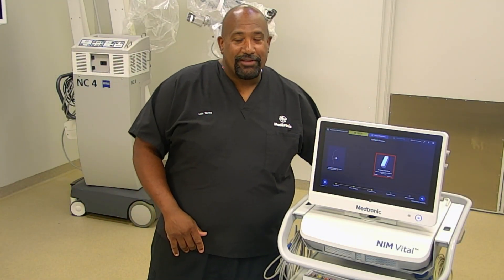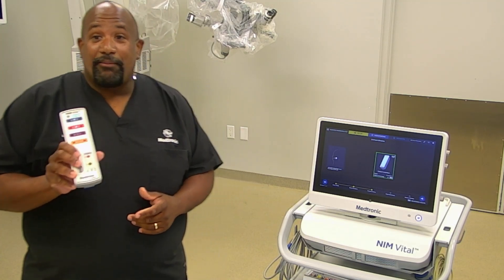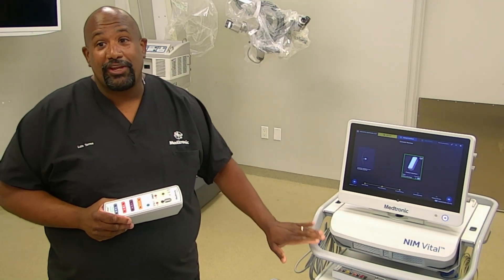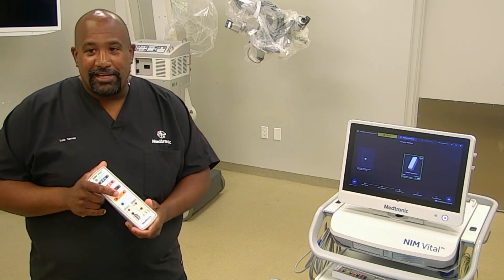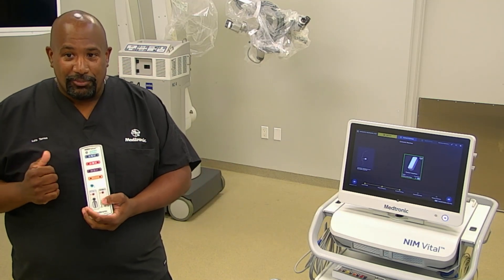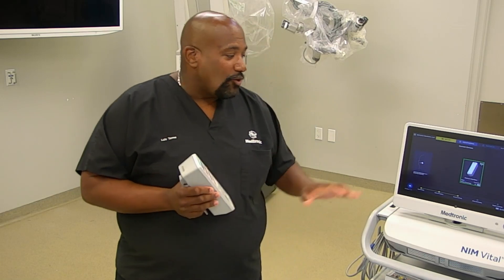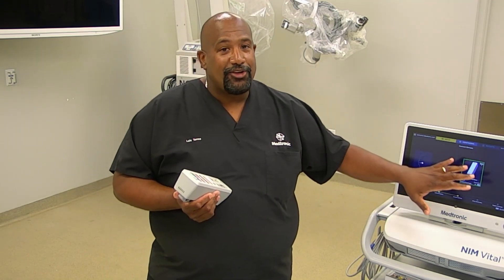Your patient interface for your NIM VITAL is wireless and works off Bluetooth. It has a battery in it, so you should always keep your patient interface docked and your NIM plugged in even when you're not using it. If you forgot to dock overnight and the battery is a little low, there is an indicator that shows your battery life. When it gets down to 20%, it will give you a warning on the screen.